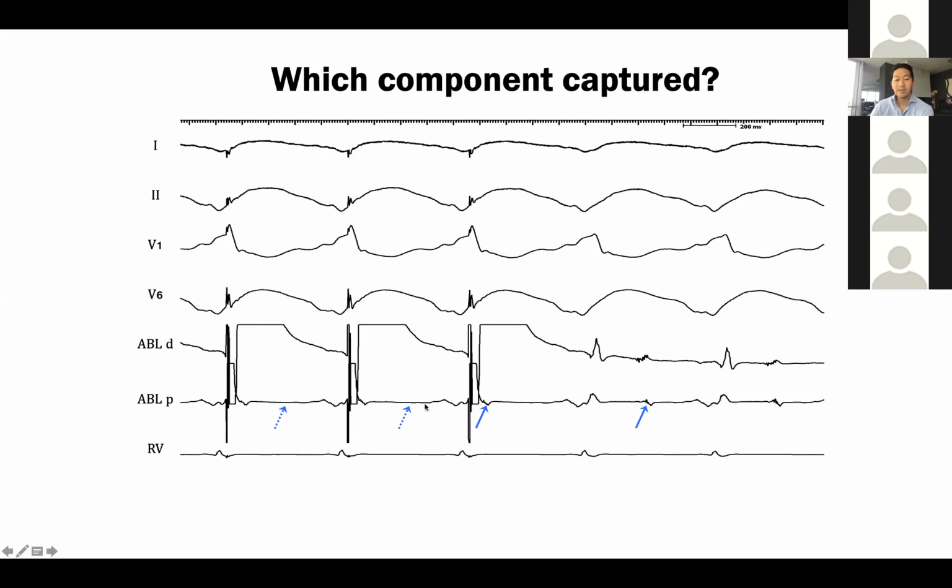It's absent during pacing, which means it is captured. It is brought in over here. So therefore you measure to this area, which is the onset of the QRS of the local potential, and it's 635. Ooh, that's 150 longer than the TCL. So that is most likely a bystander that is attached because it's concealed, so you know it's not a remote bystander. It has to be an adjacent bystander.